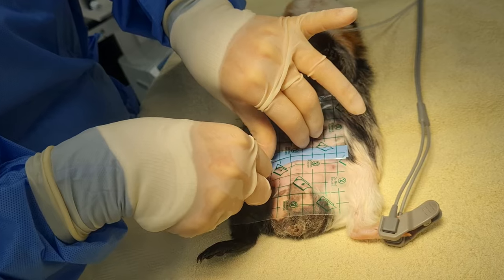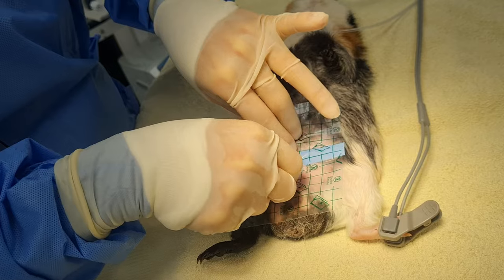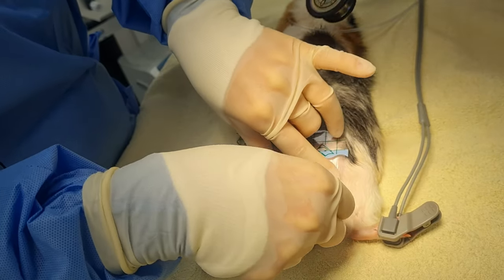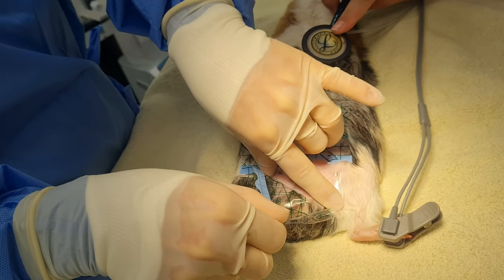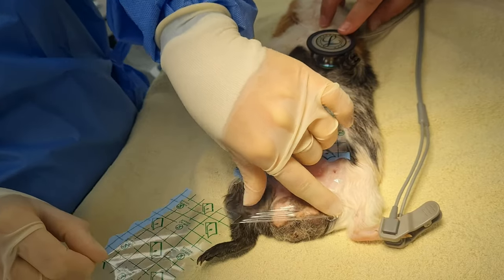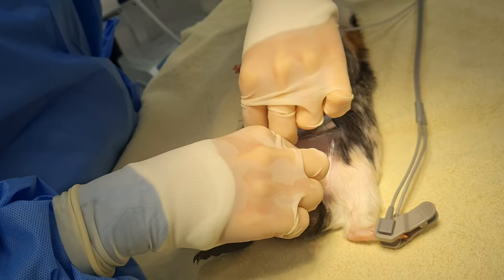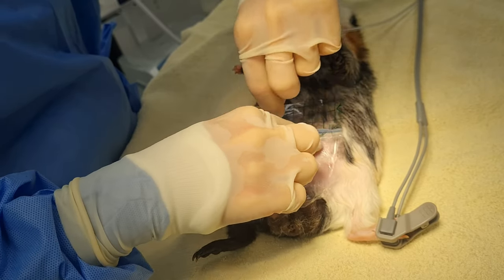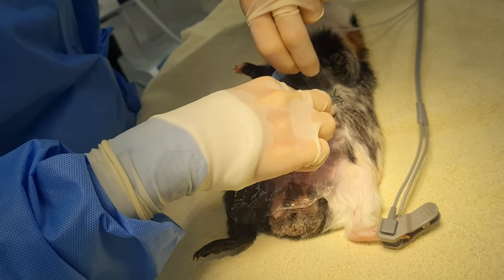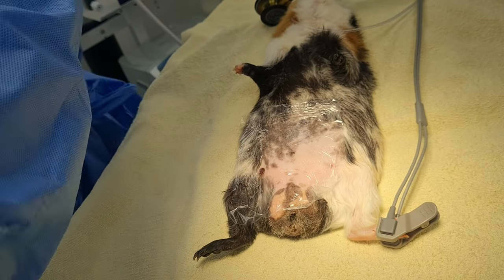These little sticky drapes we really like using. These are actually individual tattoo dressings that we buy on Amazon — much cheaper than the ones from our veterinary wholesalers. We can still sterilise them in the autoclave, and they work really well. We use them for a lot of things, not just our small furries. It just gives us a nice surgical field.